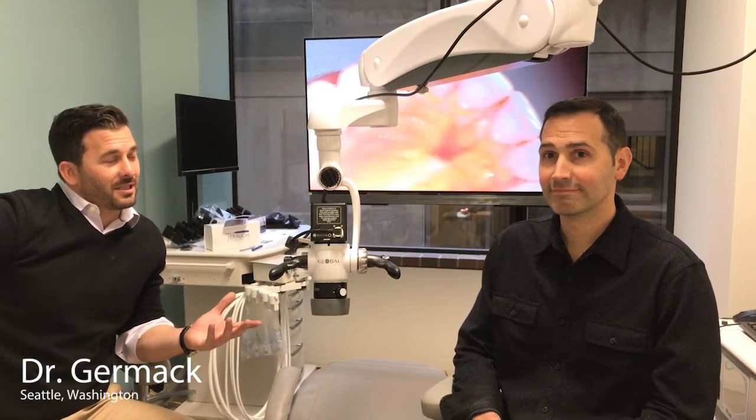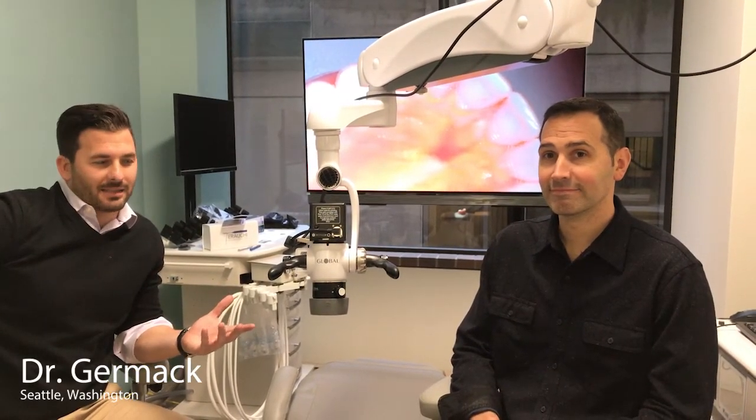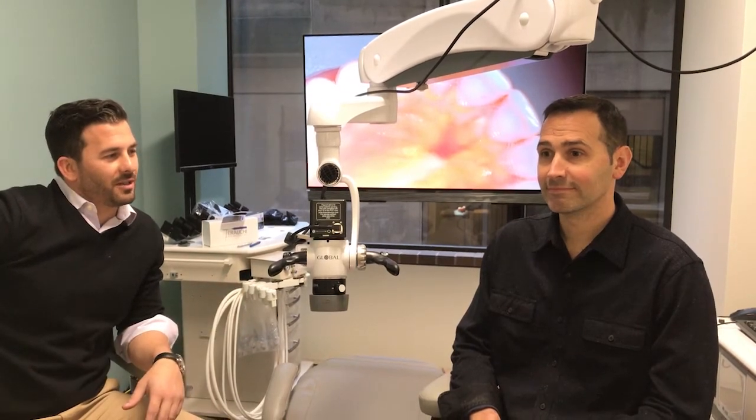I'm here with Mark Jermak and we just got the TrueVision 3D system in your office. Tell me a little bit about the technology and why you made the change.